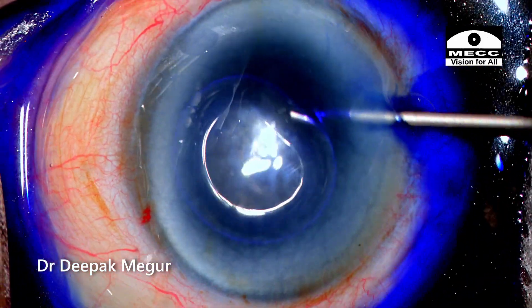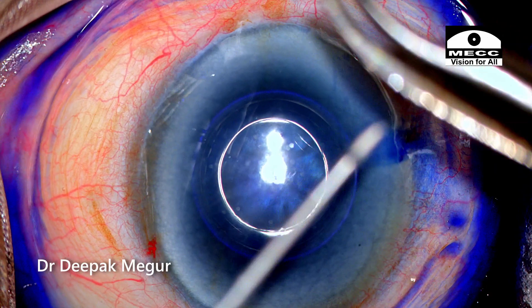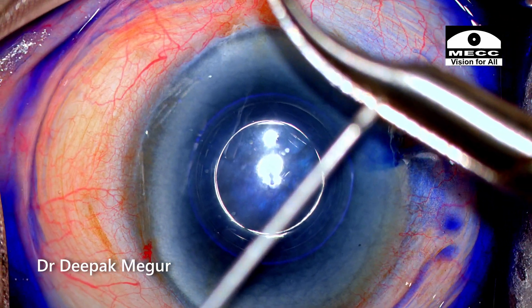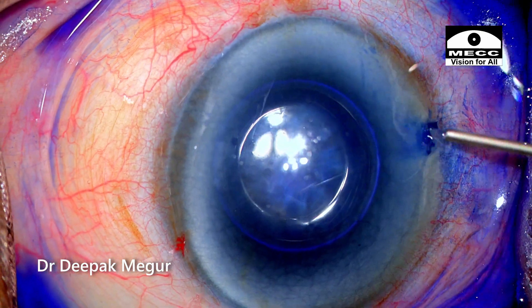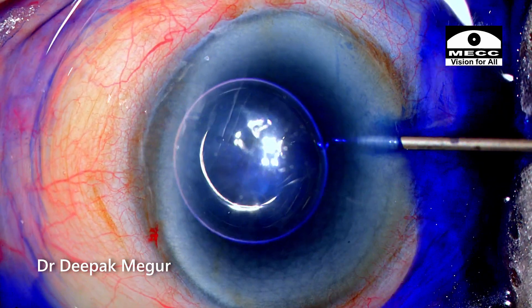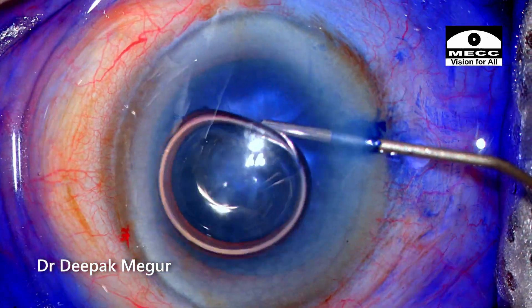The capsule is stained and it usually stays in the eye for about 15 seconds, during which I bend my 26-gauge needle which I may use for the rhexis. Trypan blue is irrigated out, followed by injection of dispersive OVD into the anterior chamber.